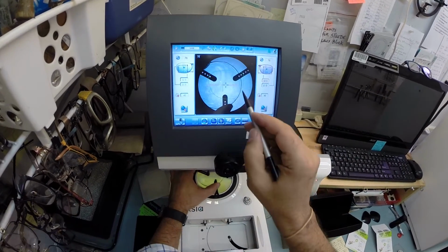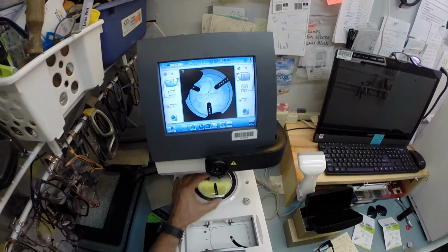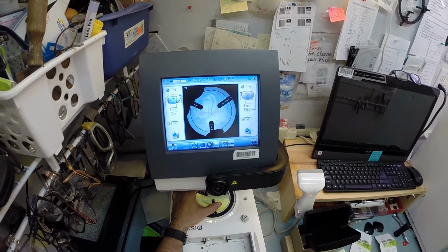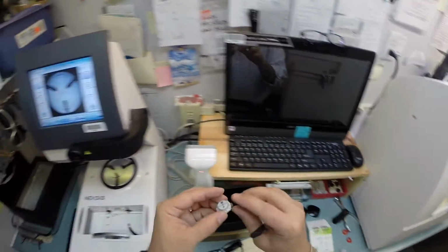And you can see, as long as I don't miss that green line, it's going to work out perfectly. Now, if this were prescription, I would have three dots on here, and I would line it up to make sure that's where it's supposed to be. This time, it does not matter. Let's pull the paper away to make the black side sticky.